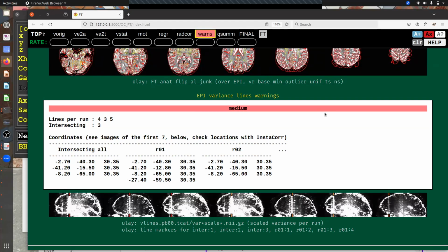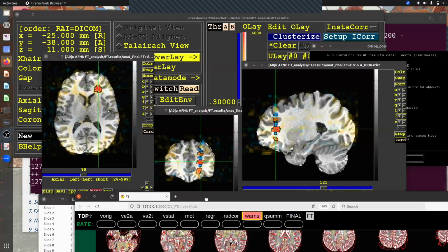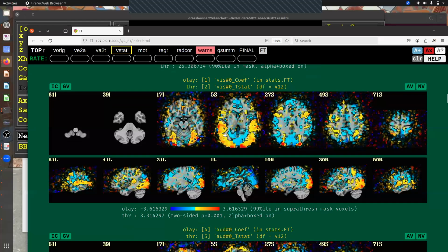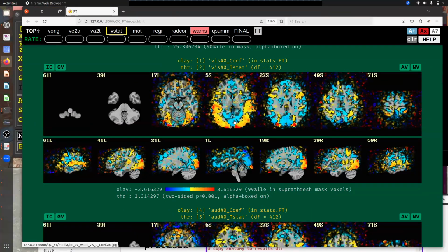About the signal in the red color map on the data set you showed. What about the blue color? In the statistic map or here? Oh, in the statistic, yeah. So I focused on the red and hot color here. What about the blue part? That is a question here. To be honest, I'm not quite sure why this would be so strongly anti-correlated.